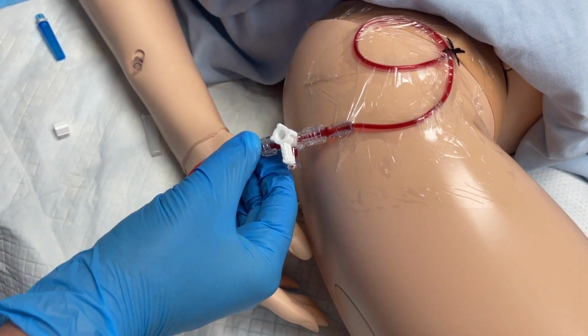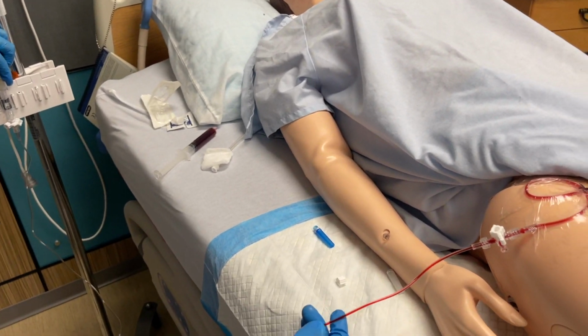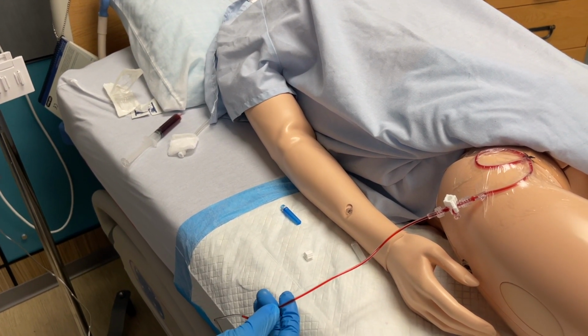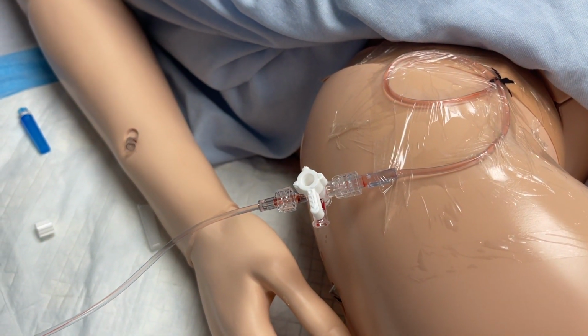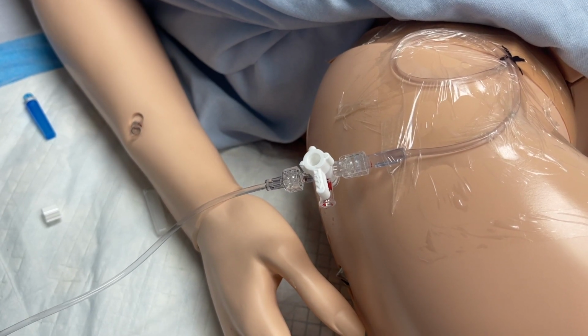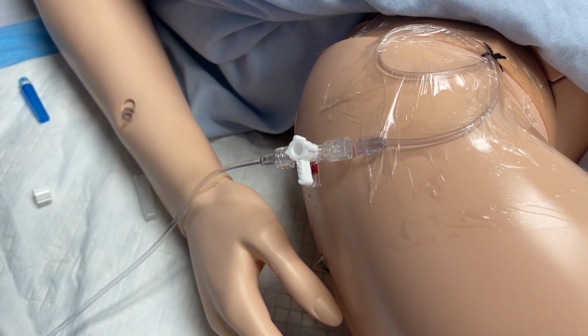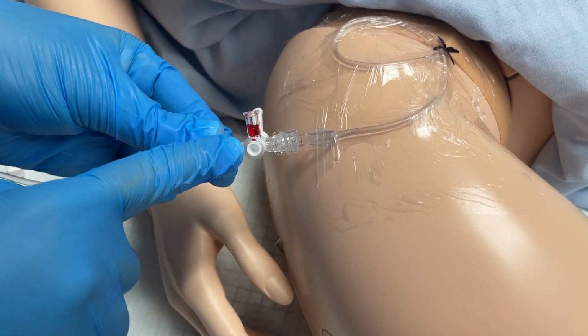Disconnect the transfer device, and then work your way up the line, and you will use the squeeze trigger inline flush. Simply squeeze in on the two tabs, and this will allow saline from your pressure bag to flow down the arterial line to clean the line. You will flush until the line is completely clear. If you look closely, you can see that the designated off-to-air part of the stopcock is now filled with blood.